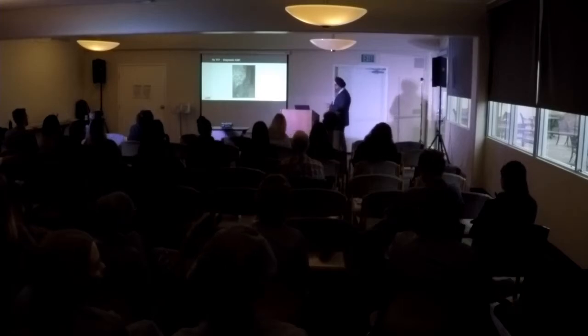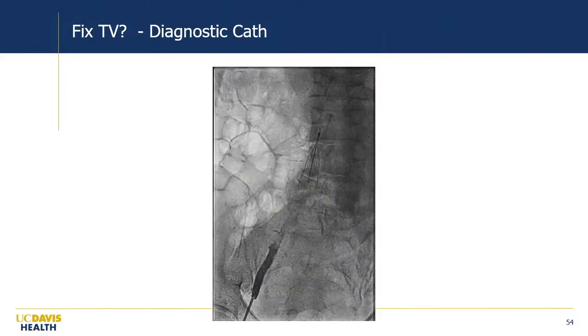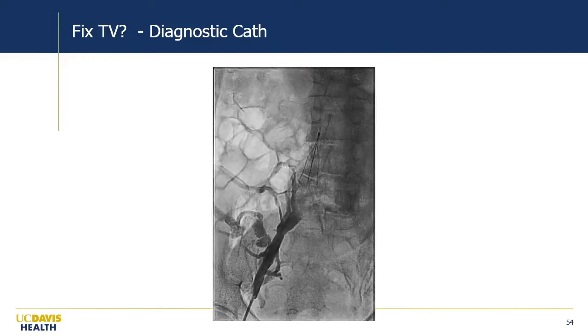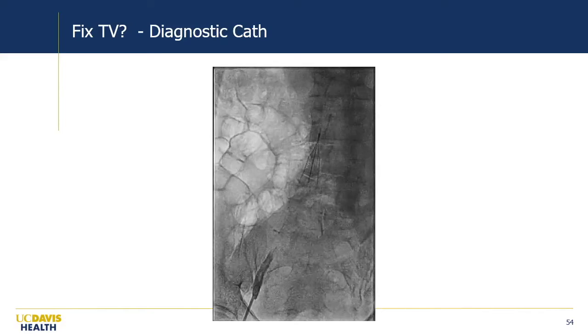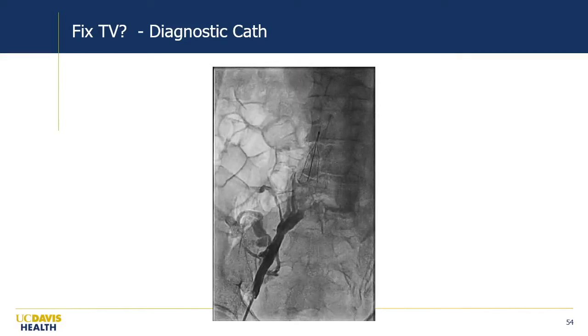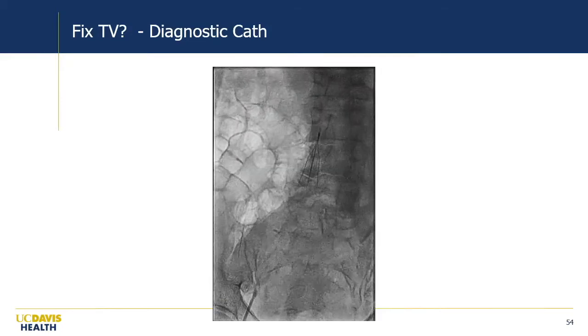Now this patient, we couldn't get up the leg. Normally when you do a mitral clip, you go up the leg. In this particular patient, he had some weird anatomy, which is not too dissimilar from a patient like this, right? So prior IVC filter, and look at that, there's actually no blood flow going up the IVC. So how do you get a mitral clip system that's designed to go from down here into the heart to help treat the mitral valve and then ultimately talk about fixing the tricuspid valve in this guy? You can't necessarily do that.